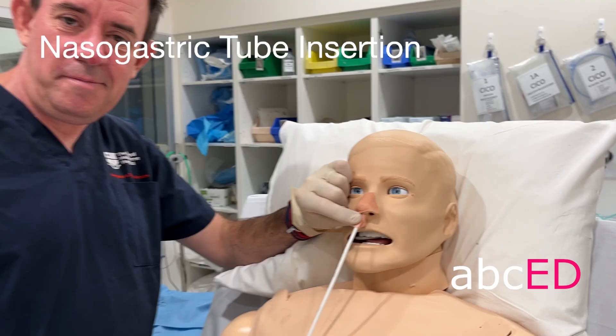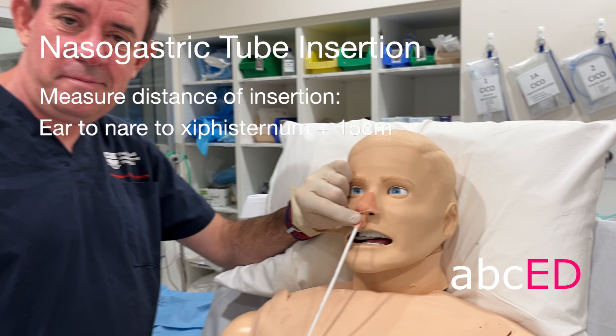Nasogastric tube insertion summary: measure the distance of insertion from the ear to the nare to the xiphisternum, plus 15 centimetres. Have the patient sitting upright and topicalize the nare.